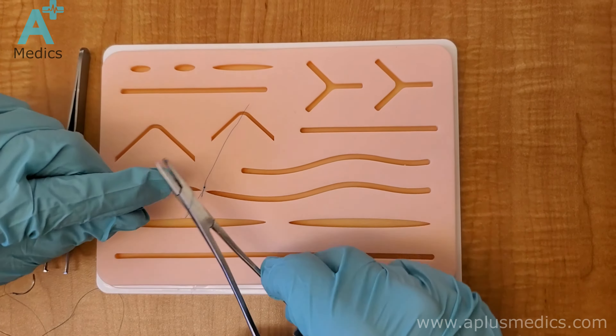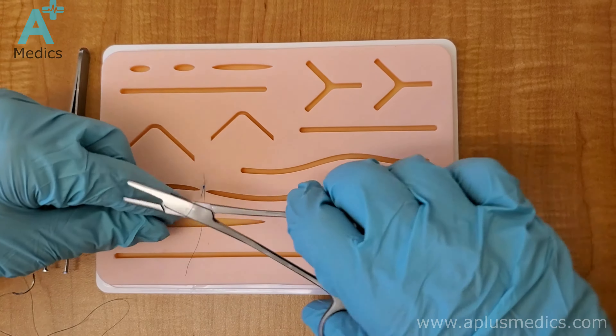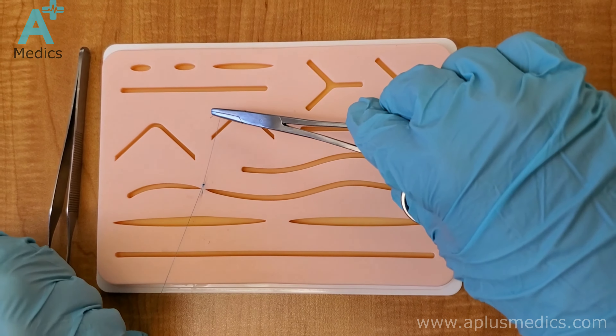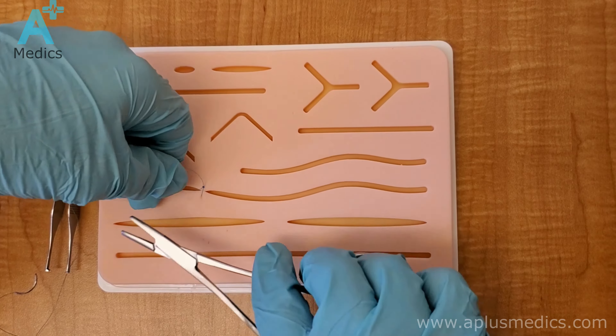Again, you always start by having your instrument parallel to the cut, grab the short end and then just pull. Grab the two strings together.